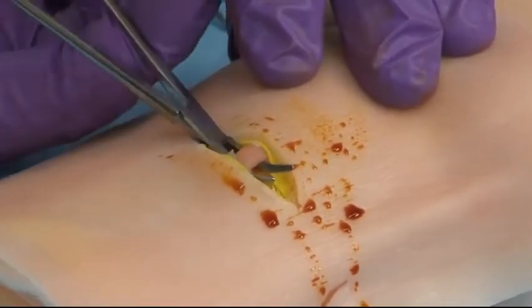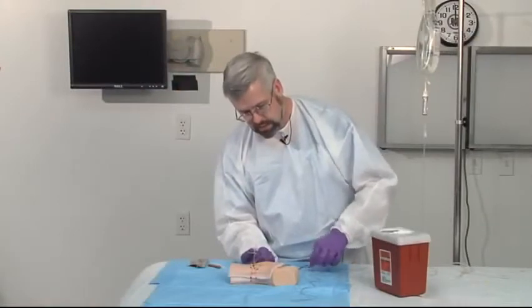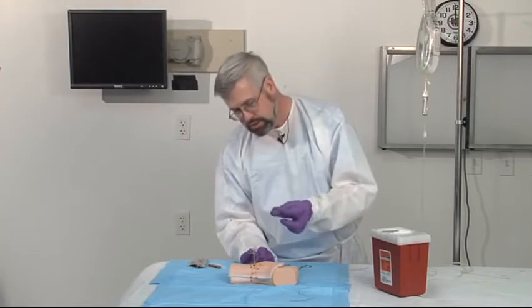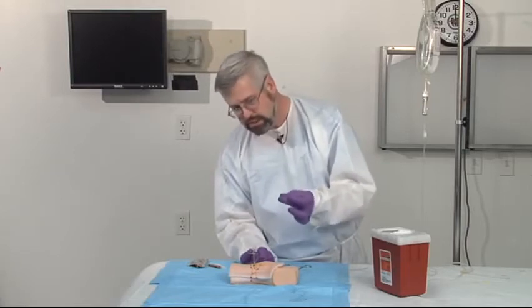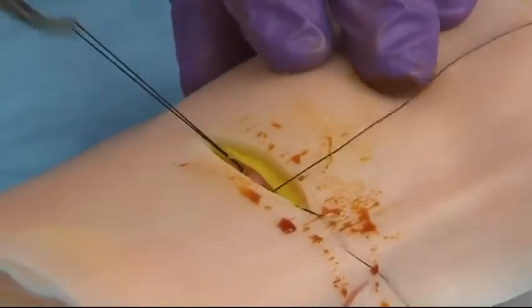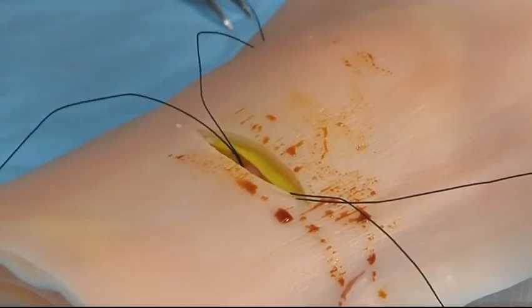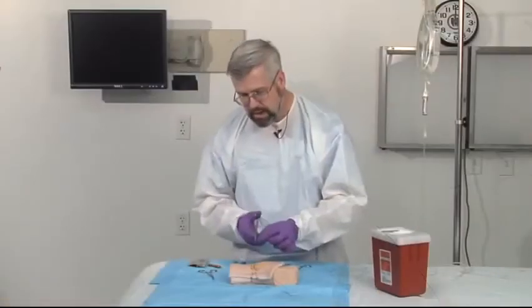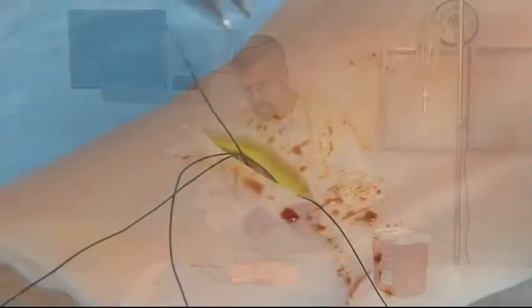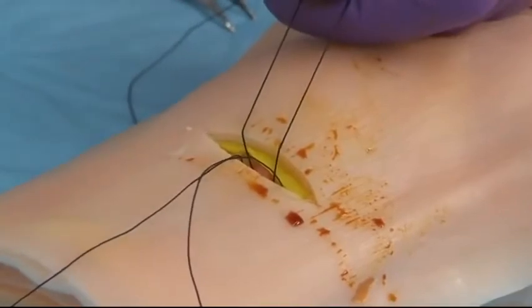Now I've got the vessel up. The key here is you want to take a silk suture and actually pass it on either side of this vessel. One trick I like to use here is just to use one piece of silk folded in half, taking the center of that and pulling it through on both sides. Now I have this looped silk through — I'm going to cut it. And now what I have is essentially two pieces of silk, one above and one below. You're going to want to tie the end that's down at the ankle because you want flow to go towards the head.